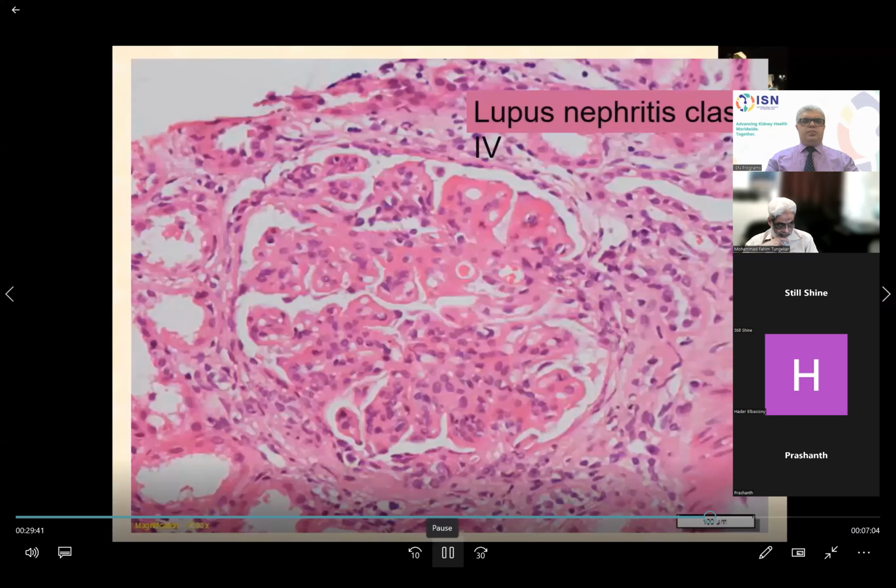And the glomerulus has remarkably altered histology, completely different. We have here huge mesangial expansion and hypercellularity. In this area, the capillary lumina, like here, are nearly occluded, completely encroached by the mesangial expansion and the hypercellularity, and here hyaline thrombi. And at this segment, we have a cellular crescent also involved from here up to here. This is a cellular crescent.